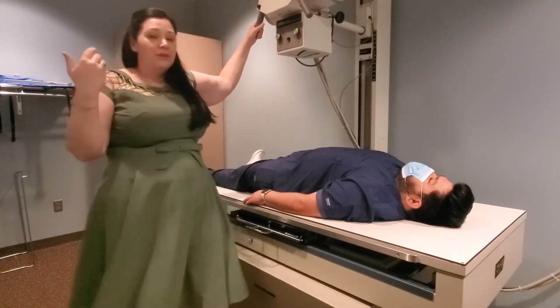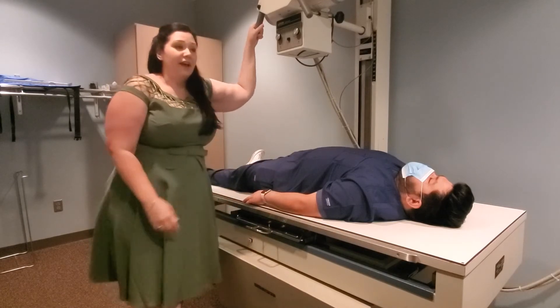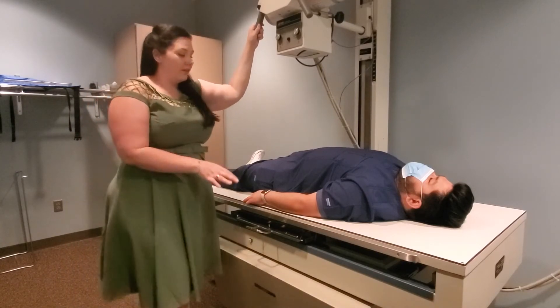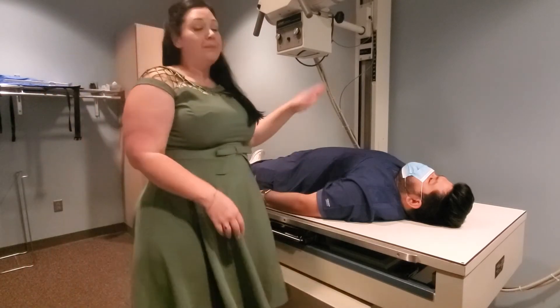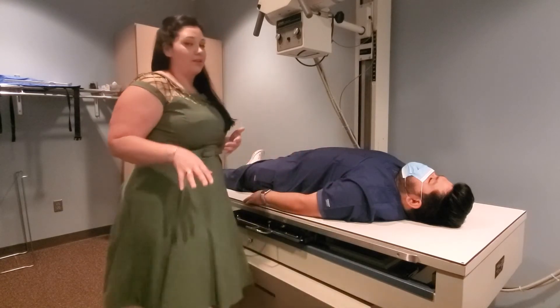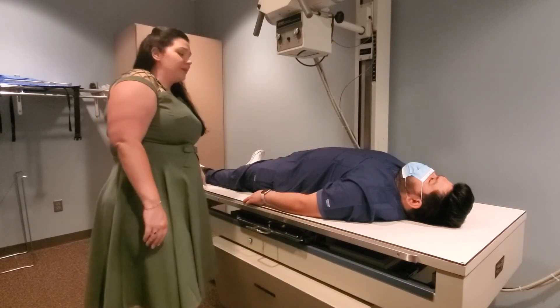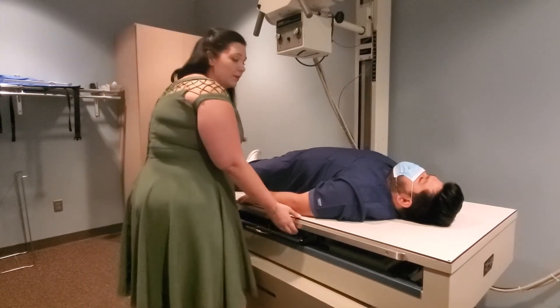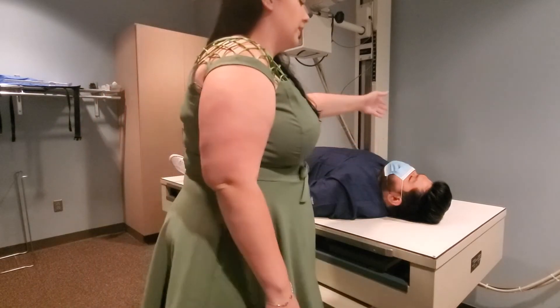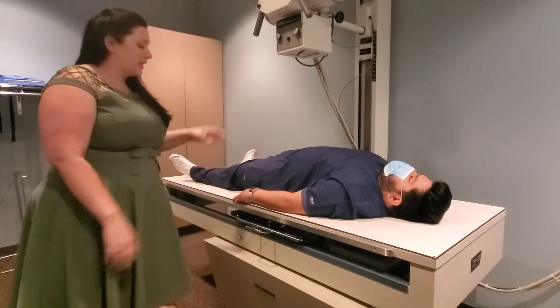If you pull the collimator head out of detent or push it too far in, it won't align with the cassette in the bucky and you won't get a picture. Work on the side of the body closest to you — for proficiency, if you pull a right recumbent humerus, position the patient's head on that side so that part is closest to you. Working on the far side means a lot of back and forth that you don't want to do, so always work on the closest side.